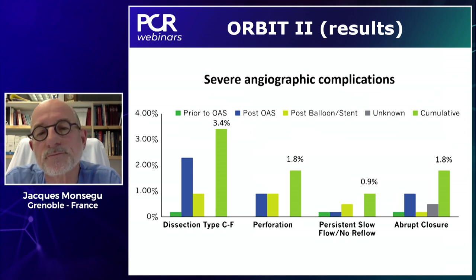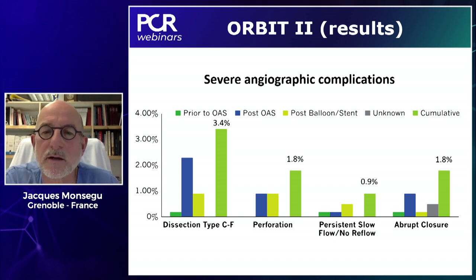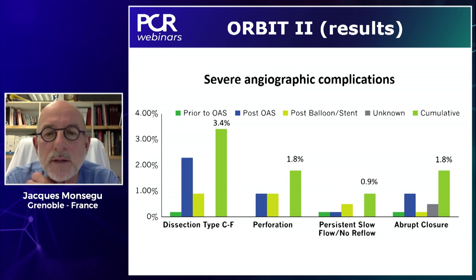Of course, a few angiographic complication with dissection, a few perforation, slow flow or no flow. Nevertheless, it was the beginning of the adventure, and now this rate of complication is very, very low. Next, please.